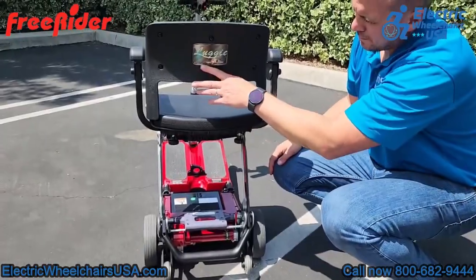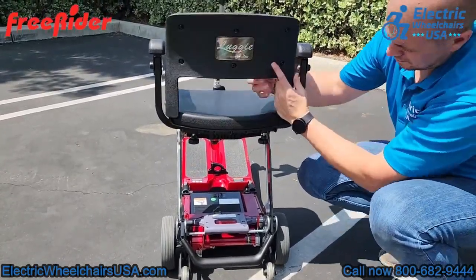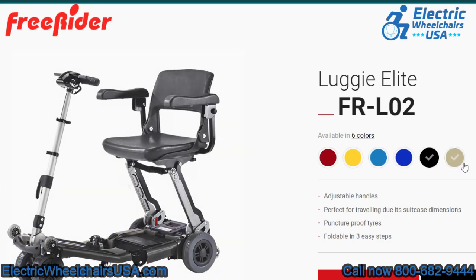With the Luggy Elite, it's important to note that there are multiple color options to choose from. You can choose from red, blue, yellow, black, and champagne.